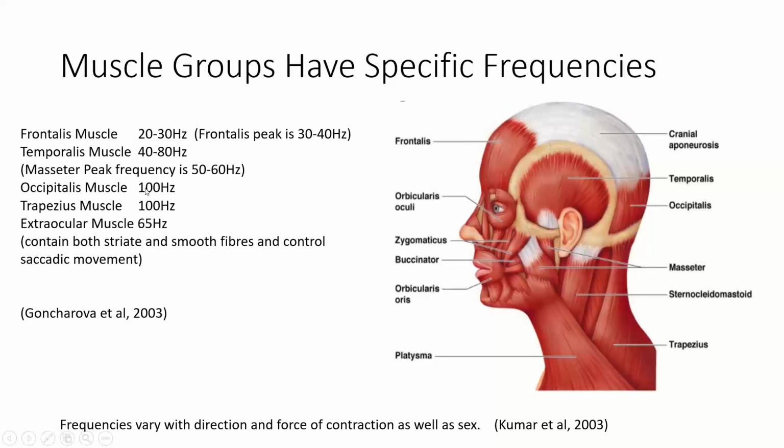We'll get into that. In the back, when people talk about muscle tension in the back, they're stretching those muscles and they're tired. That's 100 hertz. Well, we don't even measure that. How do we get that? Well, we measure it in our software through the subharmonics. Extraocular, trapezius, shoulder tension. That shows up more in the 100 hertz. How do we measure that again? We capture it through the subharmonic in our filters. Extraoculars at 65. So those are the different frequency ranges, and this will be posted. You can go up and look at this again on YouTube.